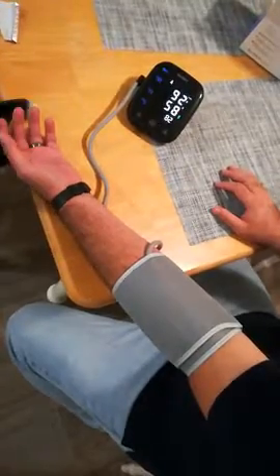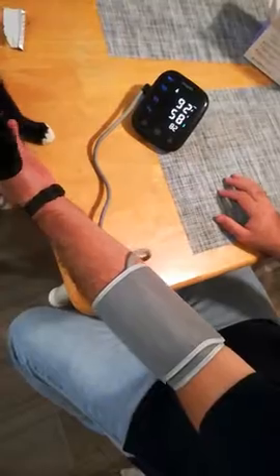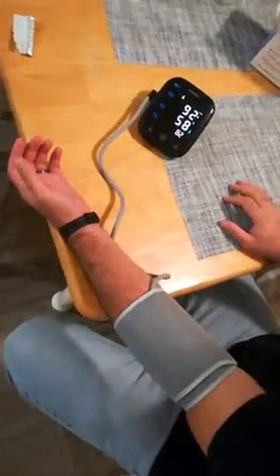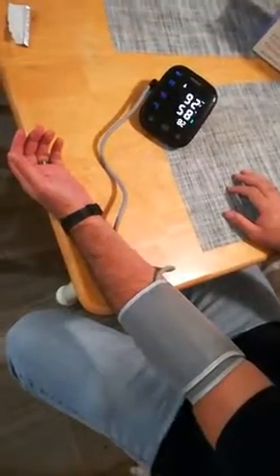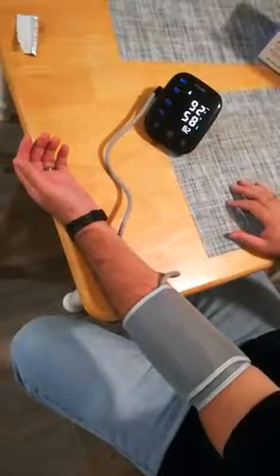Your blood pressure is systolic 92 millimeters of mercury, diastolic 58 millimeters of mercury. Your pulse was 82. Your blood pressure is normal.